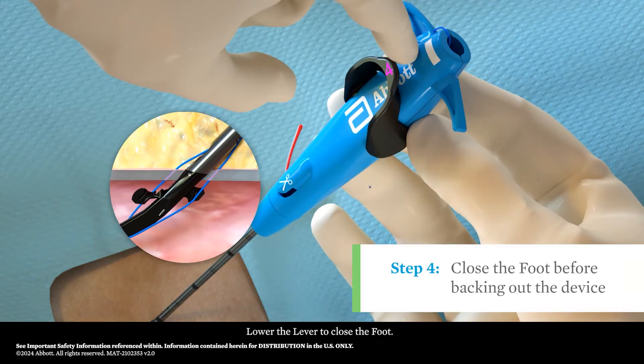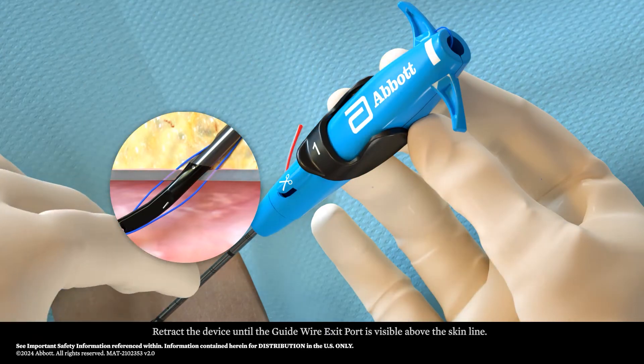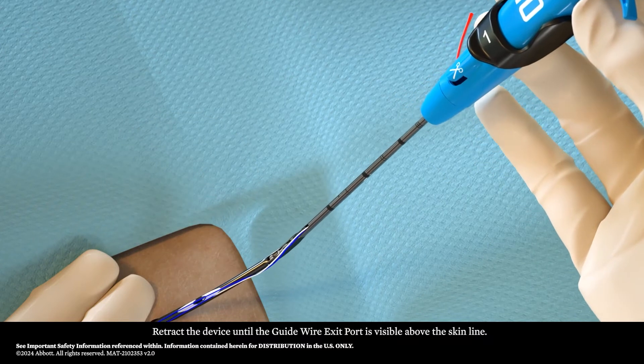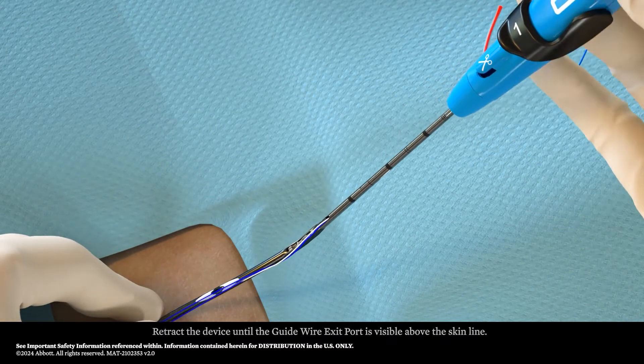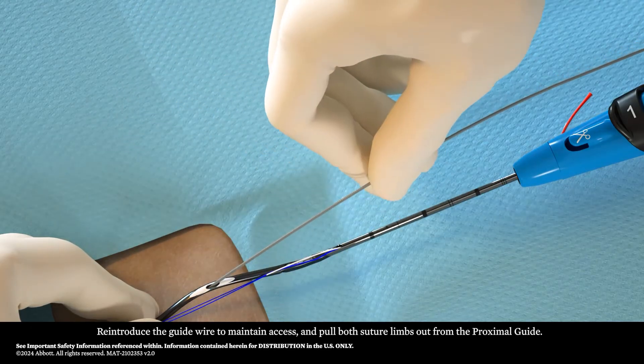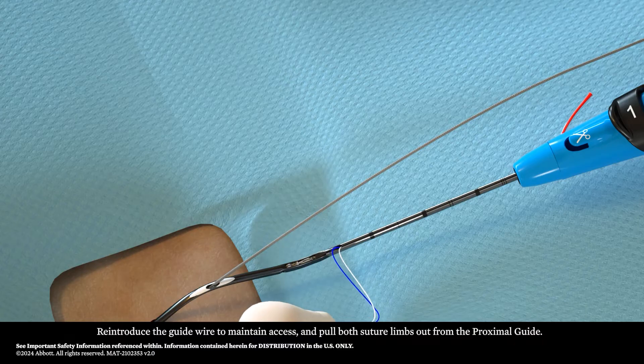Lower the lever to close the foot. Retract the device until the guide wire exit port is visible above the skin line. Re-introduce the guide wire to maintain access and pull both the suture limbs out from the proximal guide.